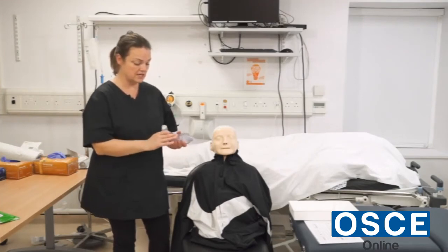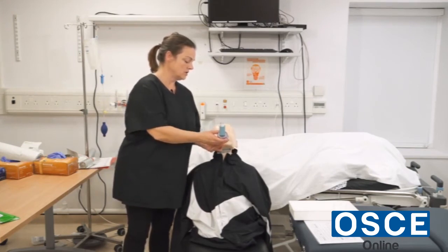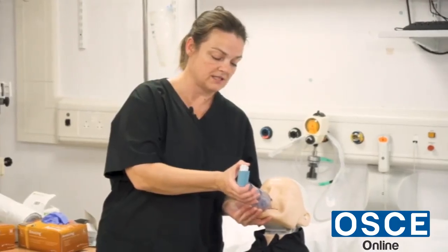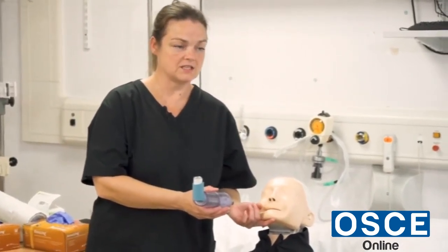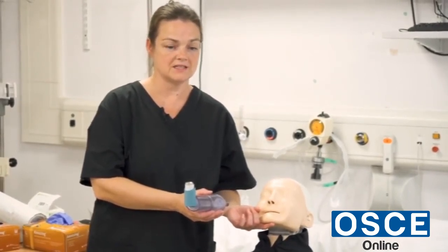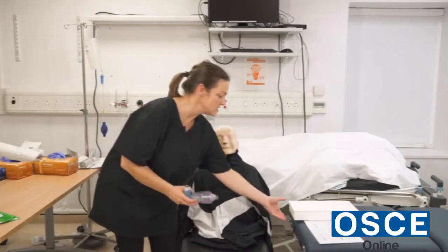So again, shake the inhaler. Tilt your head back slightly, shoulders back. Exhale. Take the device between your teeth and lips and breathe in when I press this for 2 to 3 seconds. Okay, so I want you to hold in for 10 seconds, 2, 3, 4, 5, 6, 7, 8, 9, 10, and breathe out through pursed lips. Okay, so that is done now.